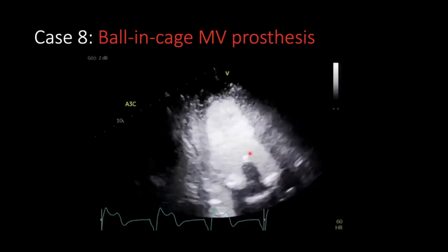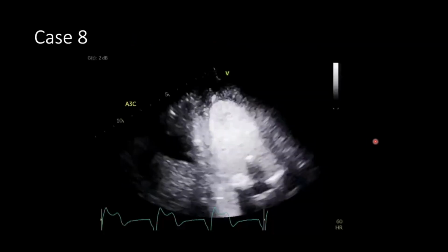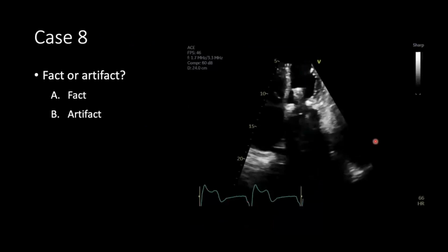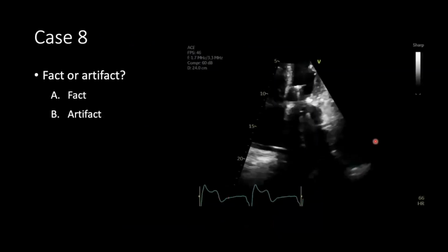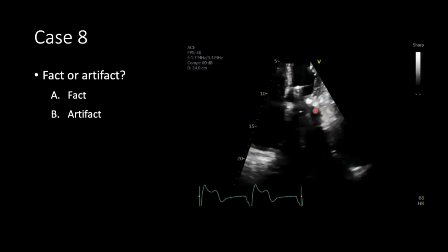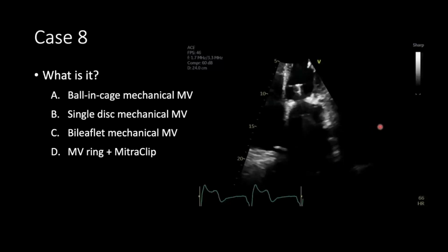Right. Yeah, and that's what you saw in the 2D image. So I'll go back to the 2D. Maybe we can also just look at that again. Sorry, just going to play the bigger version. Yeah, so this part here doesn't move, but it's hard to see that moving shadow here. But if you look very closely, there is that movement right there. So that's kind of what tips you off, but it's hard to know. That's why contrast in this case is very helpful.